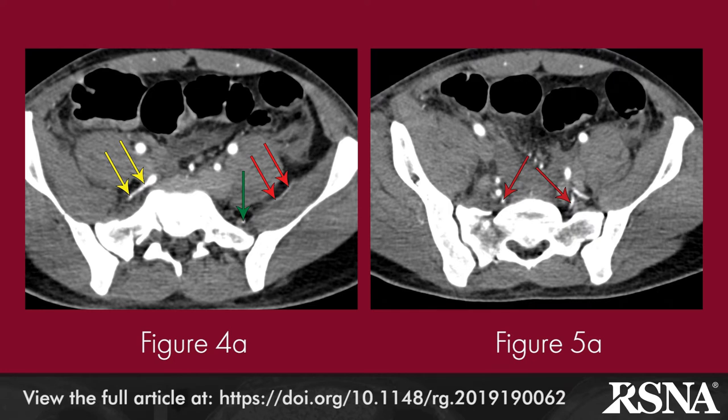Figure 5a. Axial CT angiogram in a 32-year-old man shows the lateral sacral artery as it descends ventral to the sacrum and lateral to the sacral foramina. Small branches are seen to enter into the sacral foramina (arrows).